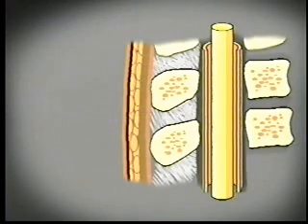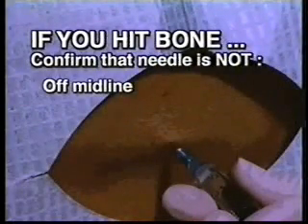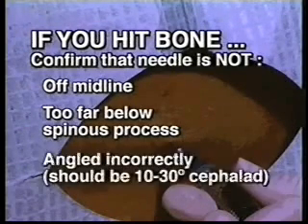What if you do hit bone? Consider whether the needle is off the midline. Make sure you are not too far below the spinous process. You should be directly below it. Confirm that you are directing your needle 10 to 30 degrees cephalad.